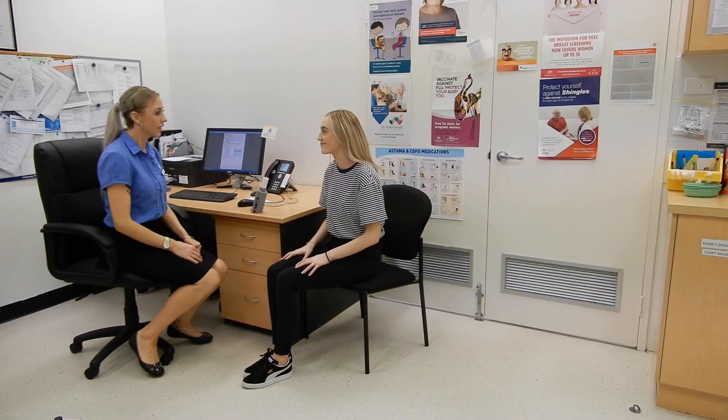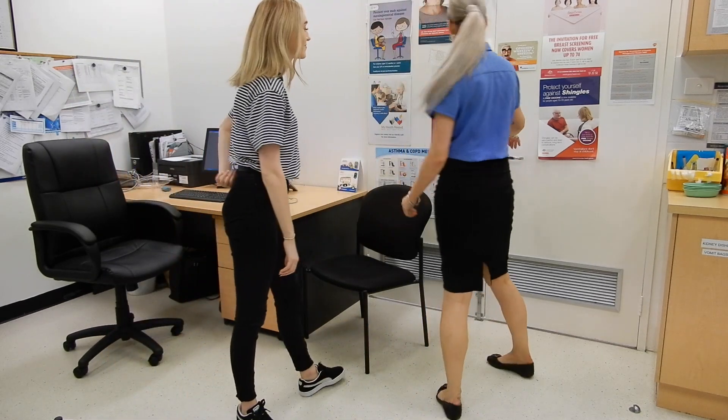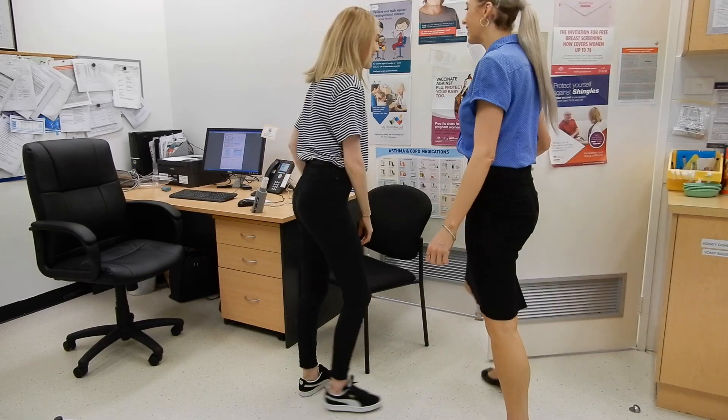Once you have inhaled the salbutamol, the nurse will ask you to return to the waiting room to wait for around 10 to 15 minutes and give the medication a chance to work. You may notice a decreased sensation of tightness in your chest, and your heart rate may also speed up. Both of these reactions are perfectly normal.